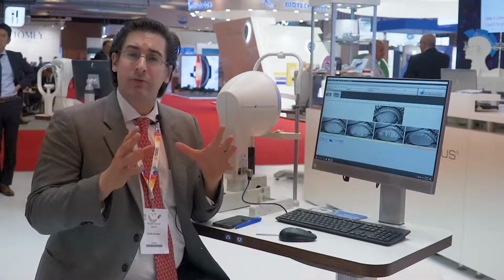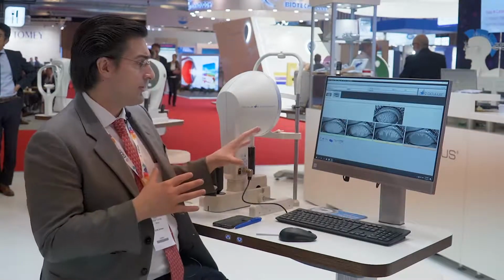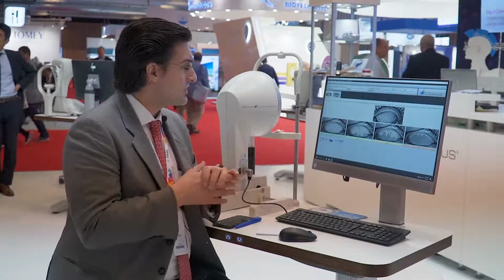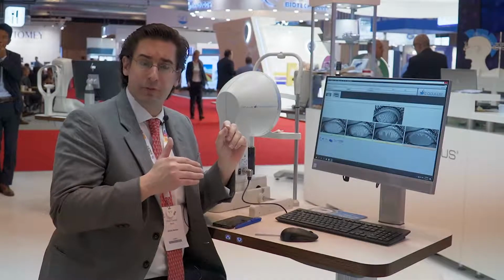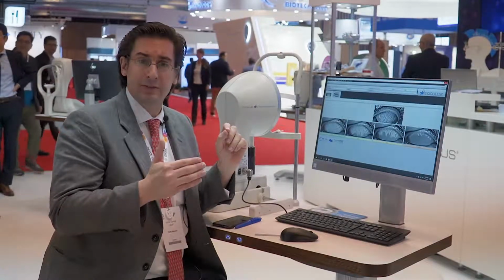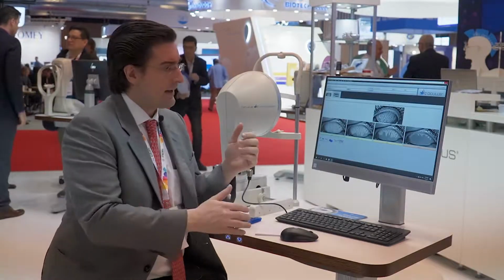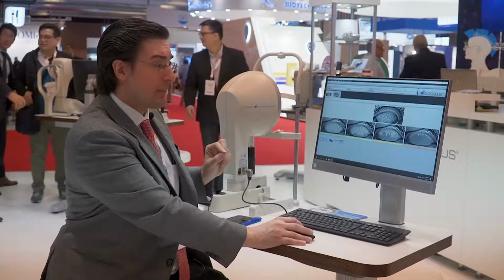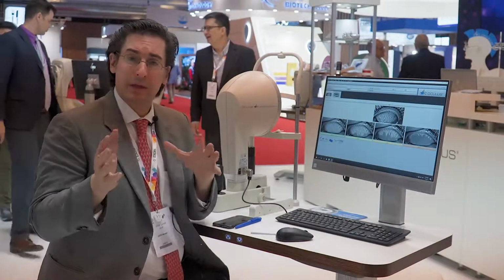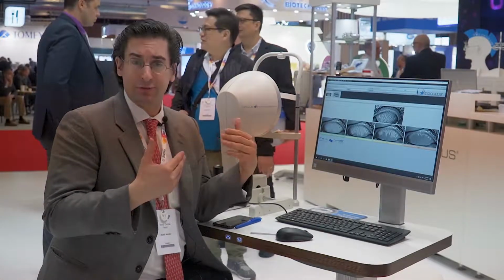Meibography, or the picture of the meibomian glands, it's a very unique characteristic for this machine. We know that when the patient has less than 50% of the meibomian glands, they are going to have symptoms, or we are going to see signs. And here is very graphic. The machine is going to take a picture, and I can show the patient, say, hey, you have a problem, we have to treat it.